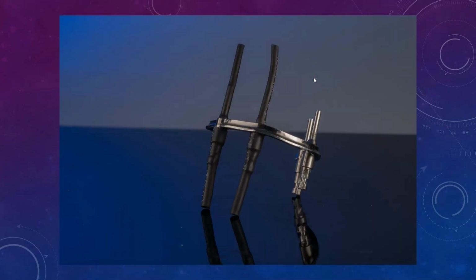So once I've designed the bar, this allows me to design the bar a lot easier, because I can see where the denture is, and when I do the scan, I'll just cut everything away except for the basal surface of the teeth, and I can see where the teeth are. So when I'm designing the bars, it works very well. The bar gets designed, I get it milled. My buddies at Elliott Milling have been so wonderful to me over the years, so they mill all my bars.